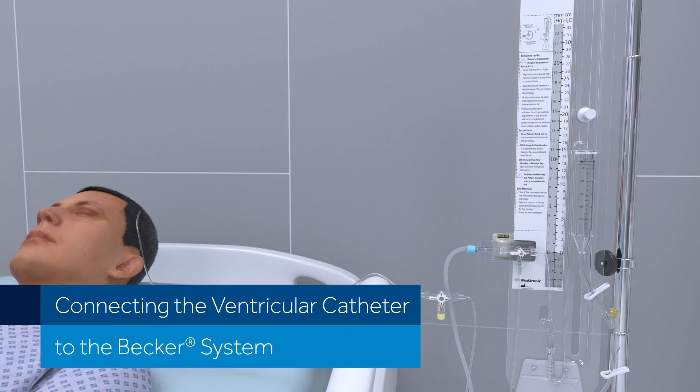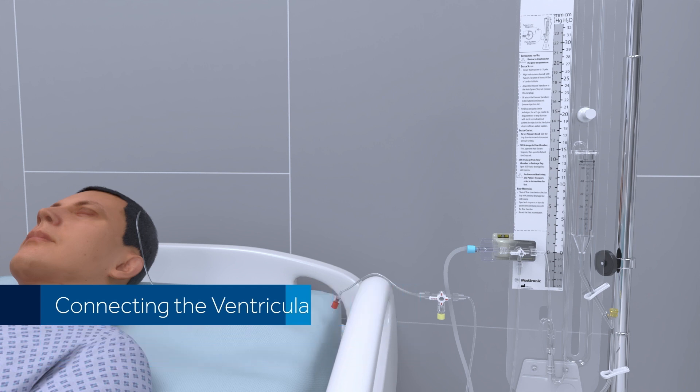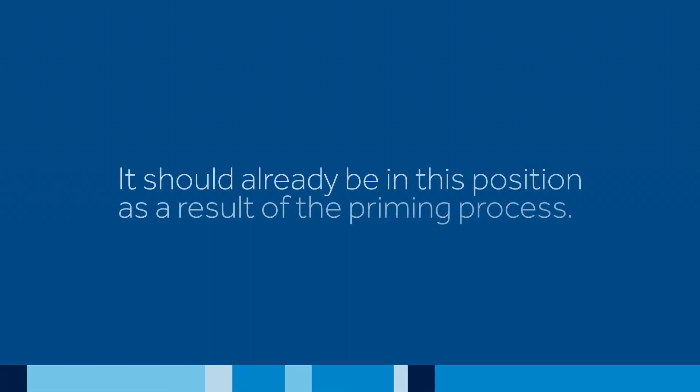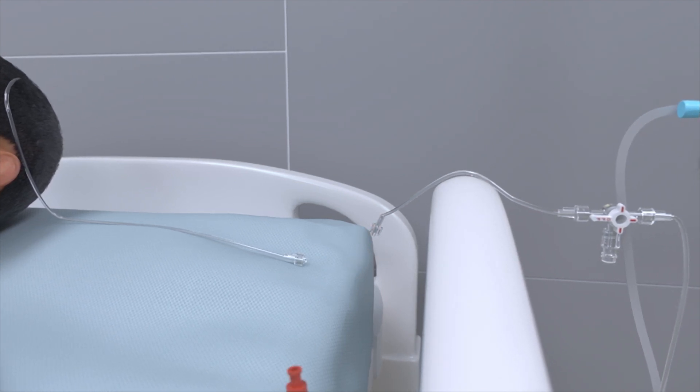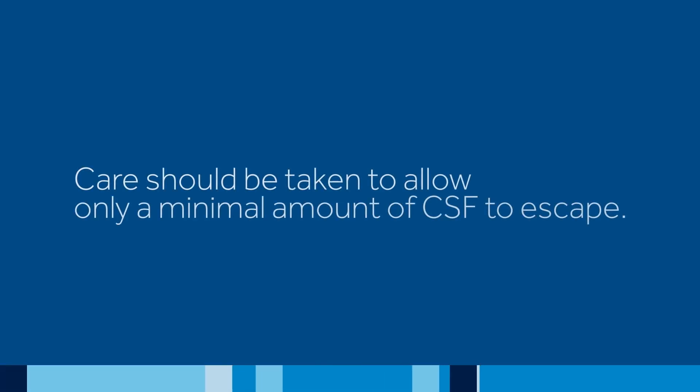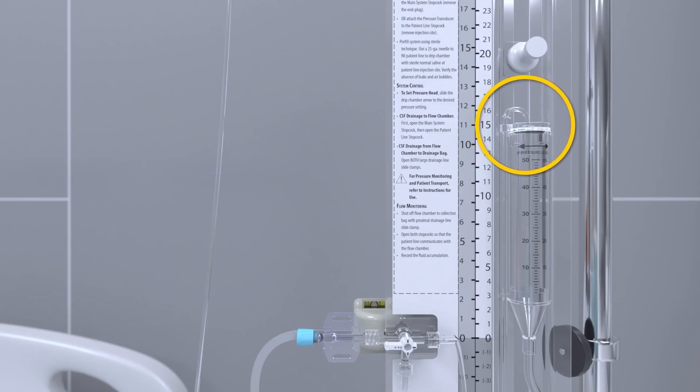Connecting the Ventricular Catheter to the Becker System. To connect a ventricular catheter to the Becker system, make sure that the patient line stopcock is rotated off to the patient. It should already be in this position as a result of the priming process. Remove the catheter cap and attach the catheter to the Becker patient line, being careful to avoid making air bubbles. Care should be taken to allow only a minimal amount of CSF to escape. Ensure that the drip chamber is set to the pressure level as prescribed by the physician and is locked into its position by tightening the thumbscrew.